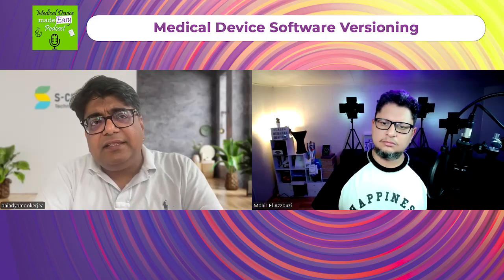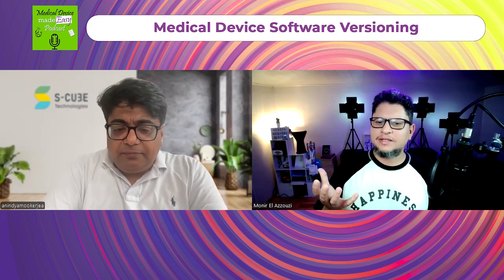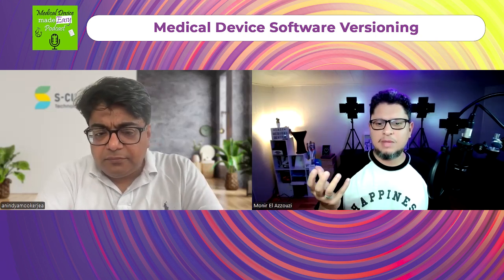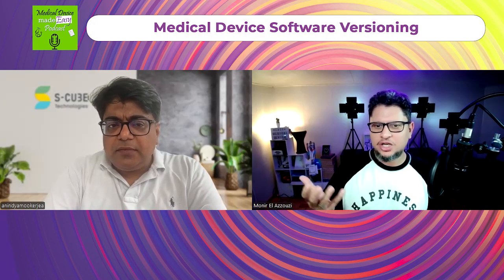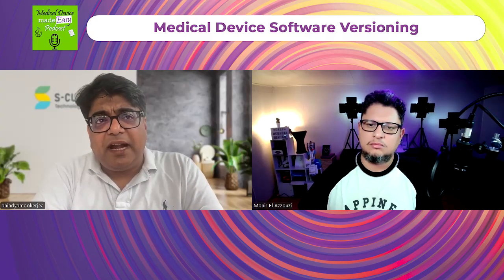The patches, as I said, may be a typo here and there. When you say typo, it's something the user will not even see if you make the change. It may not impact the safety parameters, or impact the patient or user in any way. It may be just a lowercase to uppercase in a label somewhere in the software, but it's not impacting things anywhere.